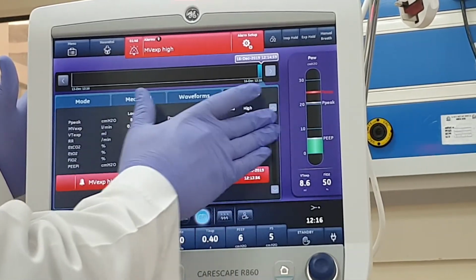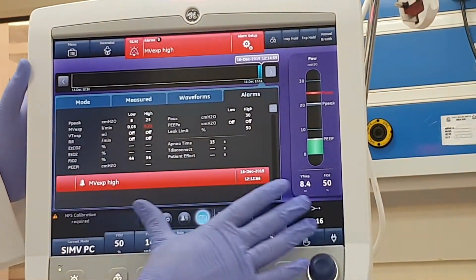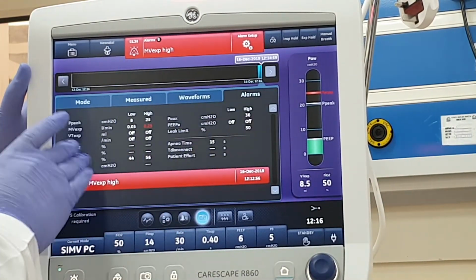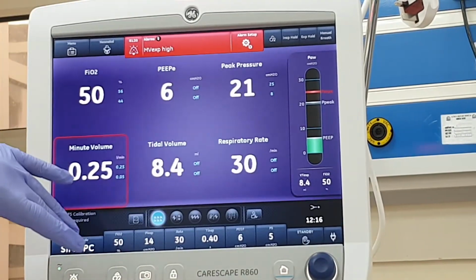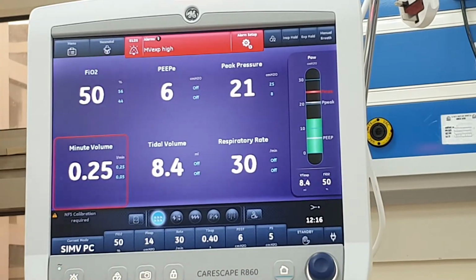Oh, that's good. No, there is water. Water? Yeah. Maybe I need to do calibration for your circuit, for your screen. Tissue? Yeah.